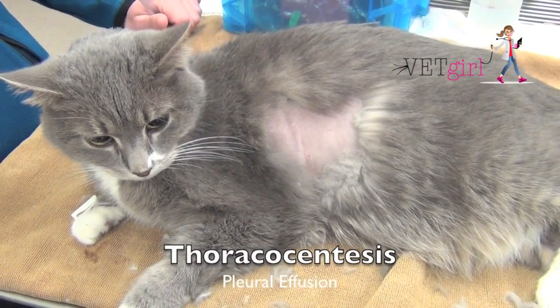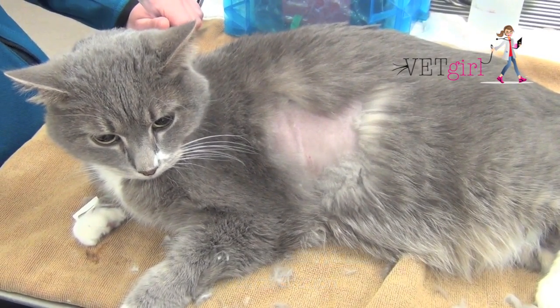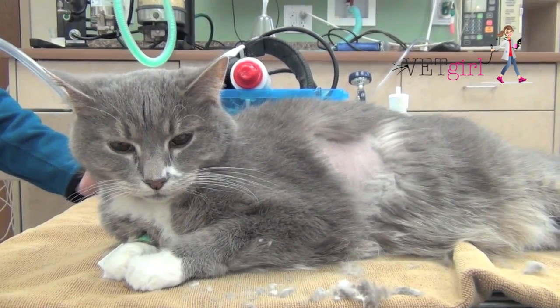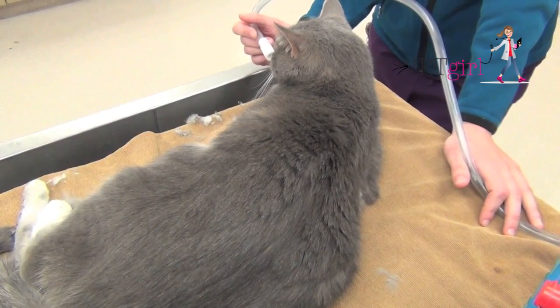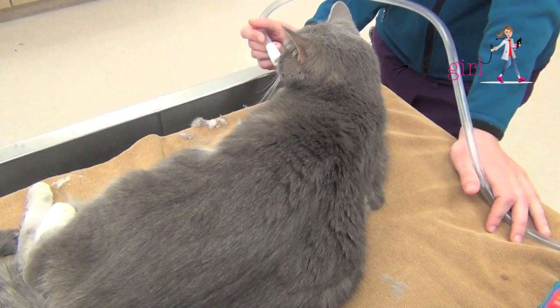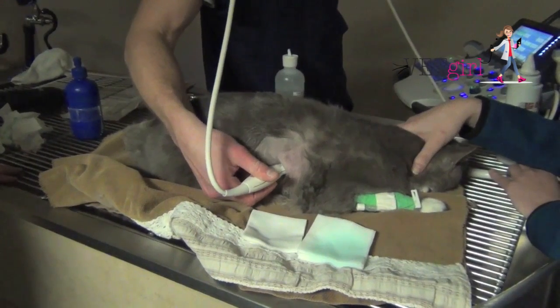In today's VetGirl video, we're going to demonstrate how to do a thoracocentesis. Whenever you see a dyspneic cat, we always want to have the cat in flow-by. We want you to feel comfortable performing a thoracocentesis because it's a life-saving, diagnostic, and therapeutic procedure.